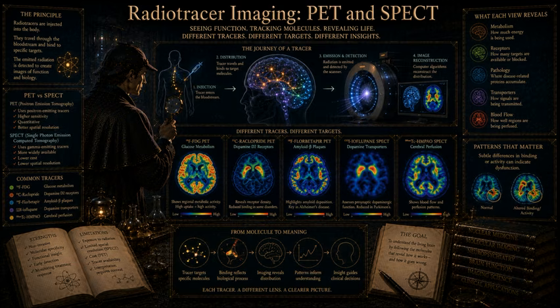Exactly. Remember, for PET to record an event, both 511 keV photons must make it out of the head unattenuated and strike opposite detectors simultaneously. Now let's take a specific line of response straight across the patient's head. Let's say the total distance across the skull on this line is exactly 20 centimeters. Now imagine an annihilation event happens on this line, very close to the left side, say 1 centimeter deep. The left-facing photon only has to travel 1 centimeter to escape. But its partner, traveling right, has to traverse the remaining 19 centimeters.